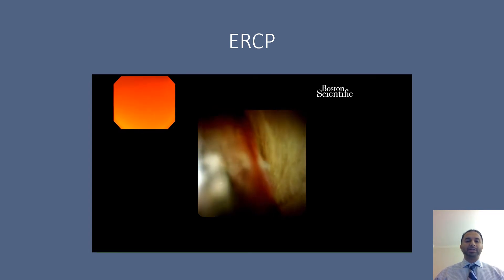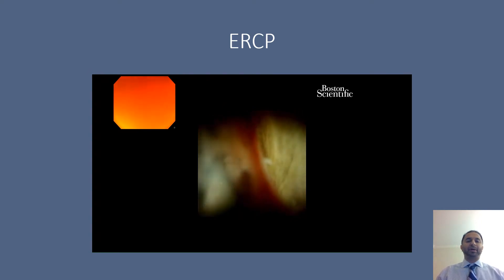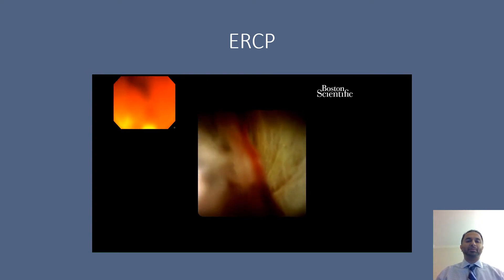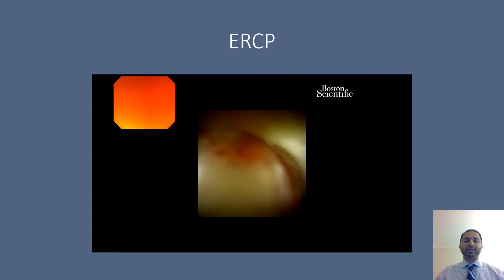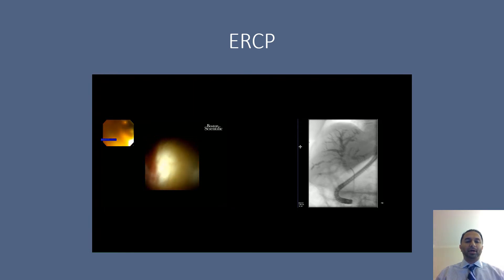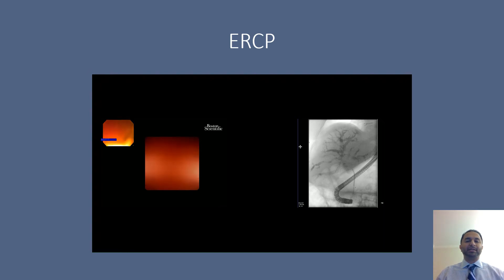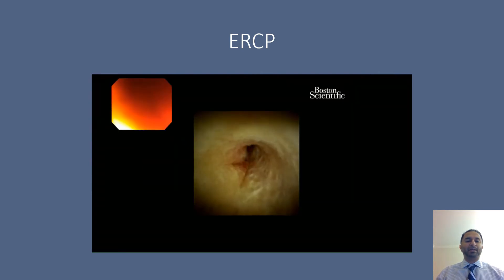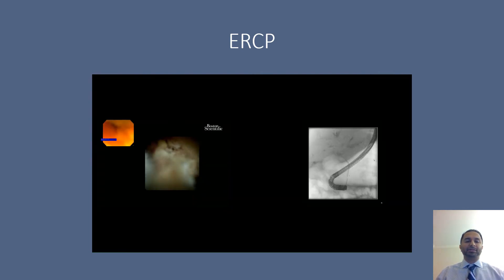This is cholangioscopy. Initially, you're seeing the distal bile duct. You can see normal-appearing biliary epithelium on the right-hand side of the screen. In the middle of the lumen of the bile duct, it looks like there's a blood clot or some abnormal tissue. When we infuse the bile duct with normal saline to get better visualization, we can see that it does appear to be a blood clot. When we are able to remove that blood clot, we do see the distal stricture.